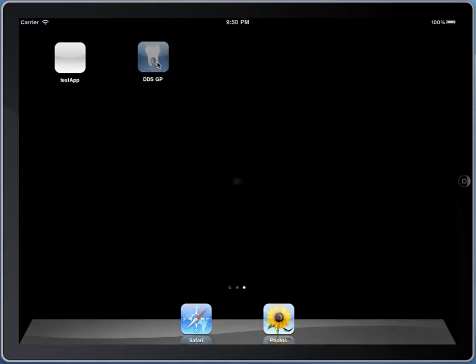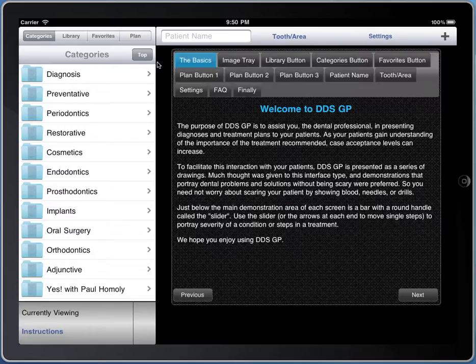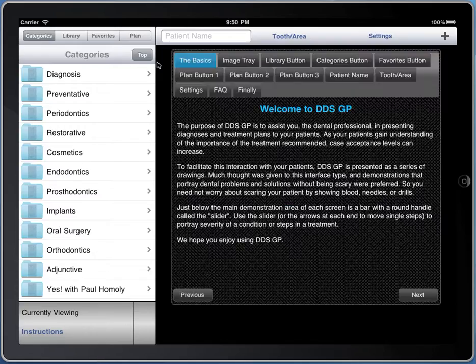Today I'd like to talk a little bit about the Nobel BioCare content in DDSGP. This video assumes a working knowledge of the software. If you need a beginner's video, there's one available on our website, ddsgp.com.